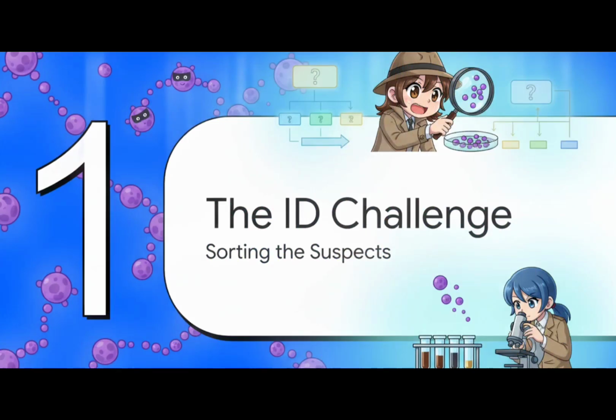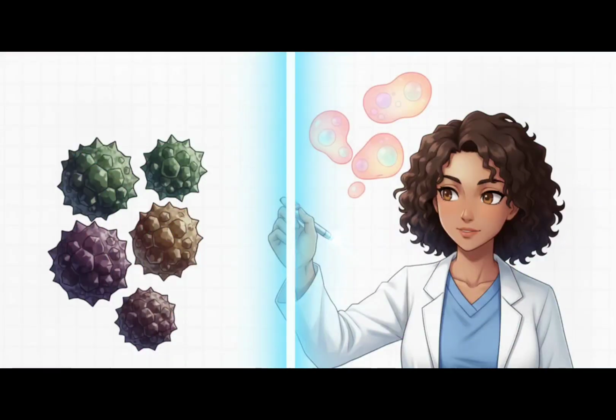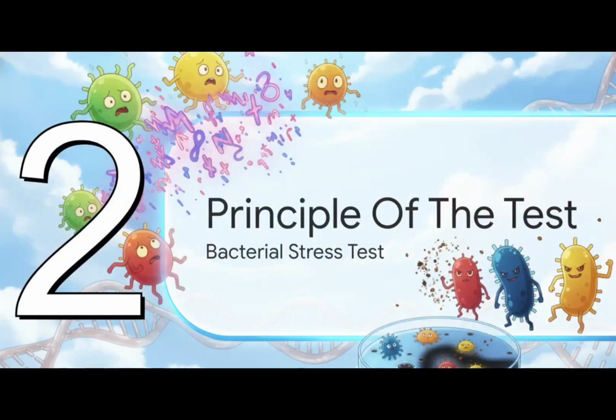Section 1. The Bacterial Identification Challenge, sorting the microscopic suspects. So our primary goal here is highly targeted. We're trying to isolate and identify Enterococci and Group D Streptococci, like Streptococcus bovis, and definitively differentiate them from the non-Group D viridans group Streptococci. This is an absolutely crucial distinction in a clinical setting, mainly because these organisms have vastly different implications for patient care and, crucially, antibiotic resistance. Misidentifying these suspects could easily lead to the wrong treatments, so we really need a specialized tool to draw a hard line between them.